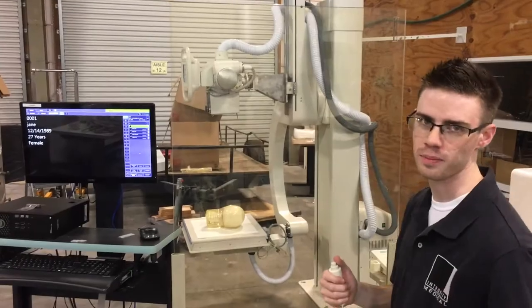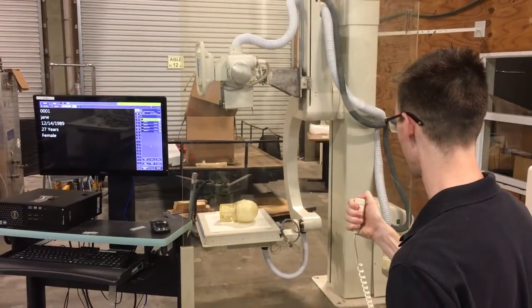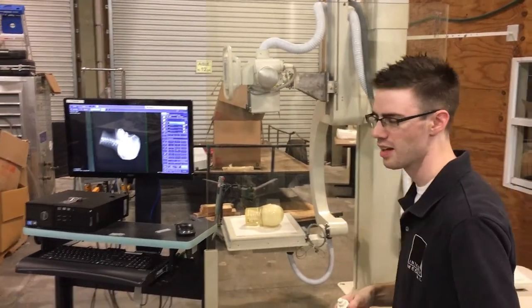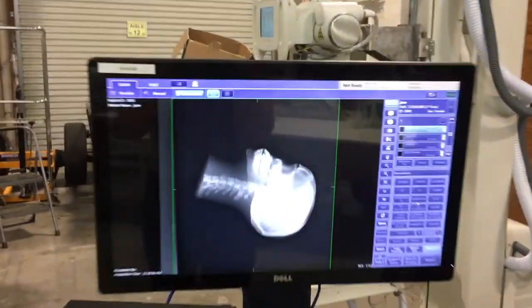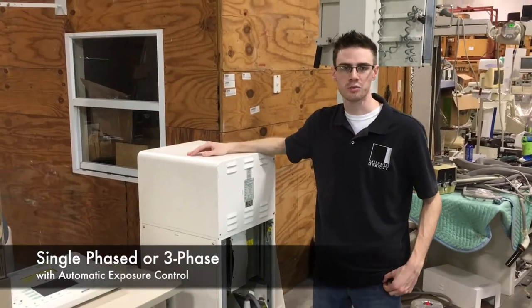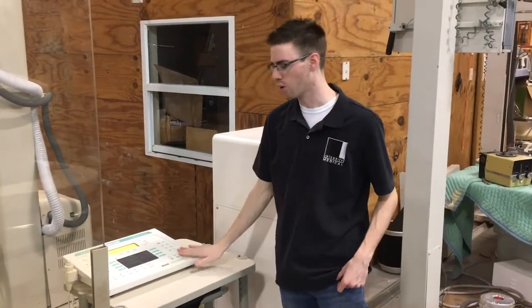Now that we have the skull positioned, we are going to do the exposure with the hand switch. And just like that, the image shows up on the screen. The x-ray generator for the U-Arm can be set up as single phase or three phase. It comes with automatic exposure control. The exposures can be done from the control panel or by the hand switch according to state law.